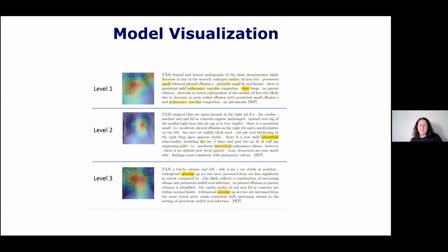Okay, the nice side effect of this model is this ability to visualize what the model is doing. For those of you who have done machine learning, you know that GradCAM or something like that is very commonly used in computer vision to highlight the part of the image that contributed the most to the decision of the classifier. Well, it turns out it's a completely useless model for medical image analysis. I'm exaggerating, but only a little bit. So the challenge with models that highlight the part of the image that contributed mostly to the classifier in medical imaging is that, well, let's run through a thought experiment.